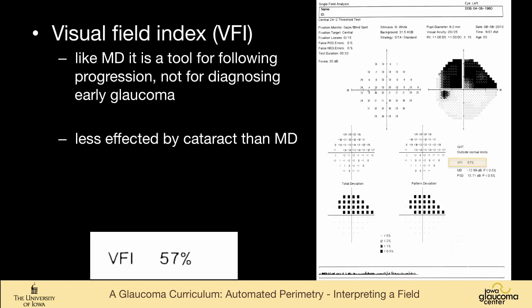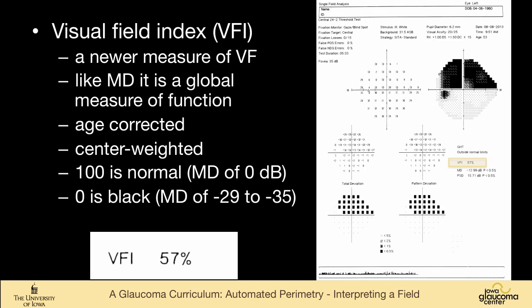And this is the field we looked at earlier with the pseudo false positive look. The visual field index is another measure of global field loss. It's like the mean deviation. It's a tool for following progression, not making the diagnosis. You can see this patient's visual field index is 57%. It's supposed to be less affected by cataract than mean deviation. And it's relatively newer.